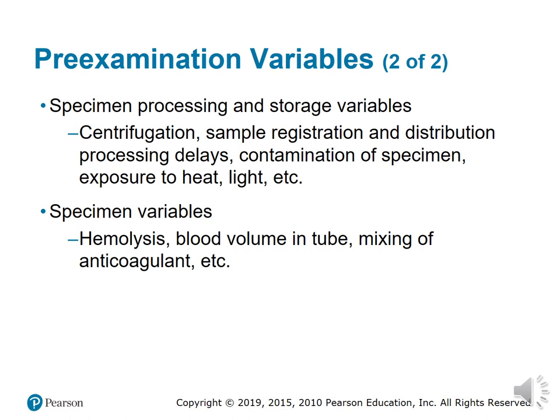We have to be mindful of contamination. Try not to cross-contaminate or contaminate your blood sample. So if you're going into an infectious precaution room, your samples stay outside the door. You're not supposed to bring your tray in the door anyway, but be very mindful not to accidentally have other samples anywhere near that area.